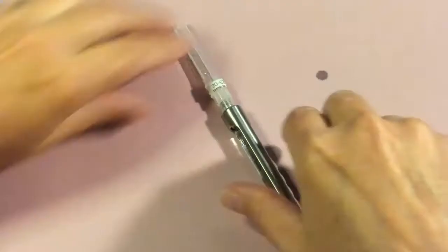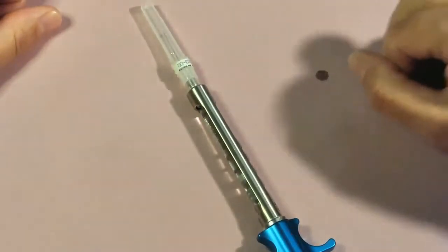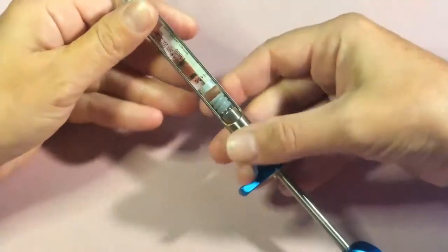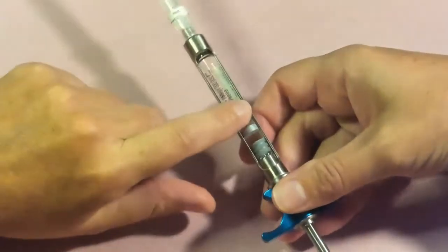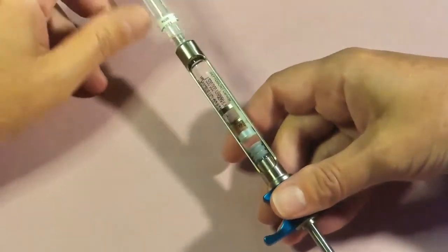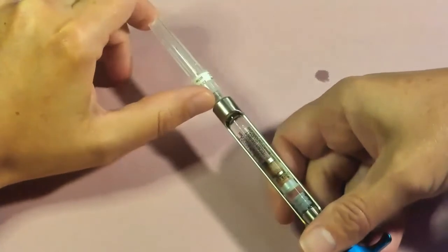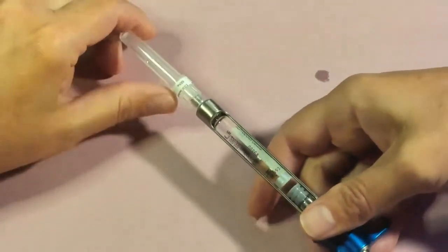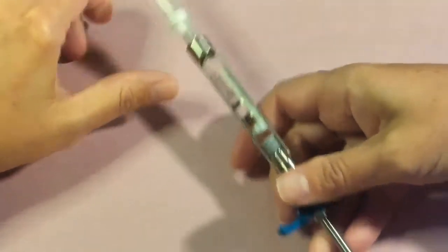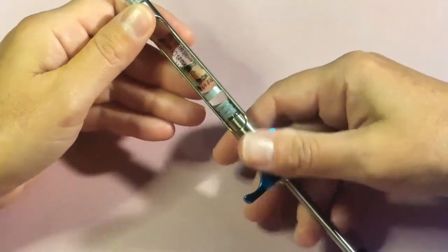Any time you go to reload the syringe, or your harpoon becomes disengaged, you always want to remove your needle first. Whether you have a positive aspiration, need more anesthetic, or need to re-engage the harpoon — if you don't remove the needle first you'll dispel anesthetic unnecessarily. Always remove your needle before removing the cartridge or re-engaging your harpoon.